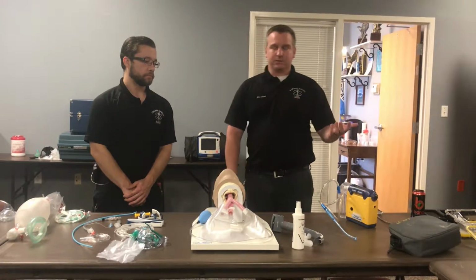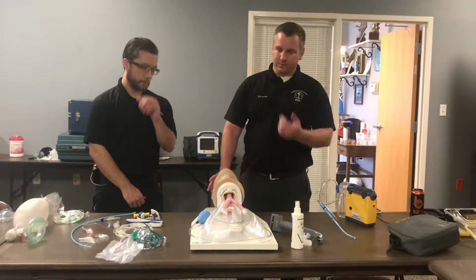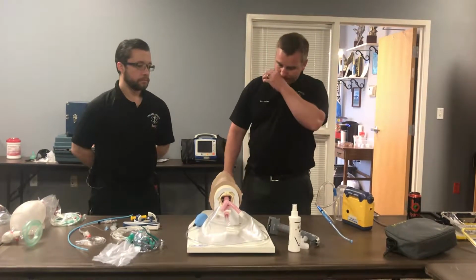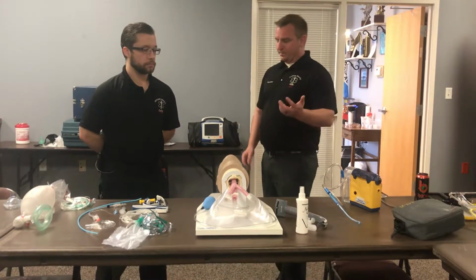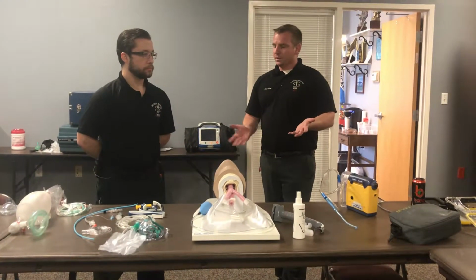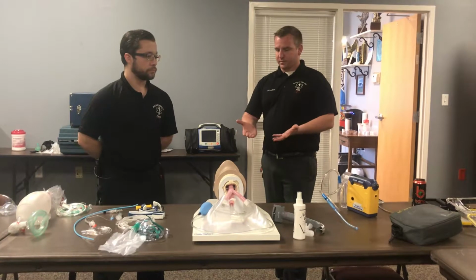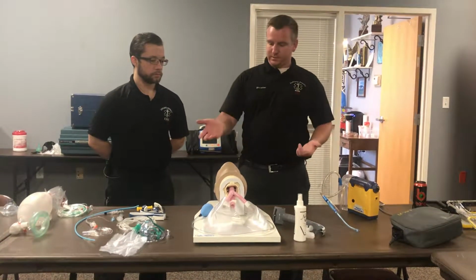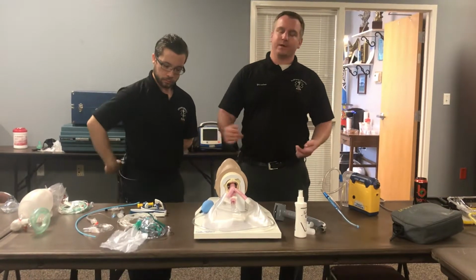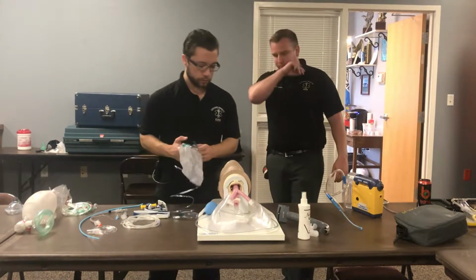So we all know the indications for an RSI. If not, we will cover them further in the CE. We just wanted to show you a video presentation of the actual procedure. So we have our patient here. Levi has recognized the patient's respiratory distress. He's decided that he's going to put a non-rebreather on the patient while he further assesses the patient.